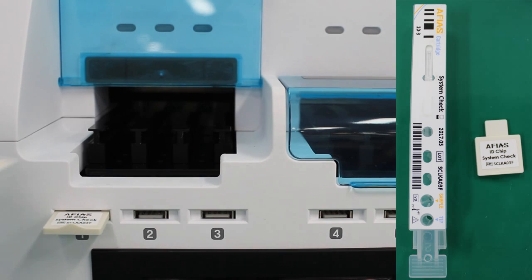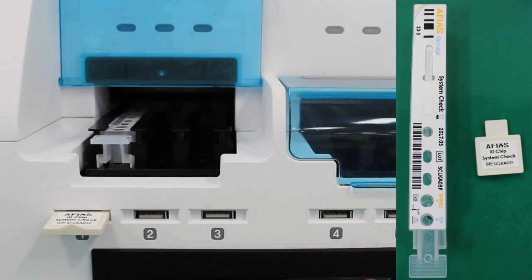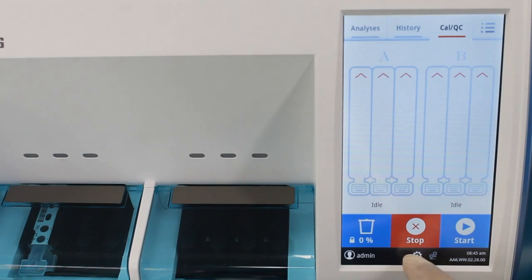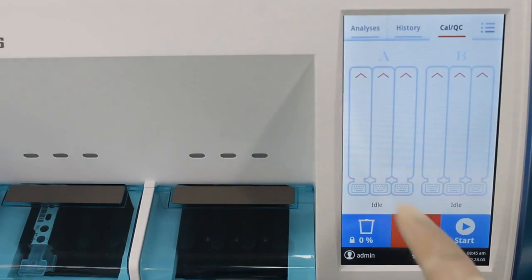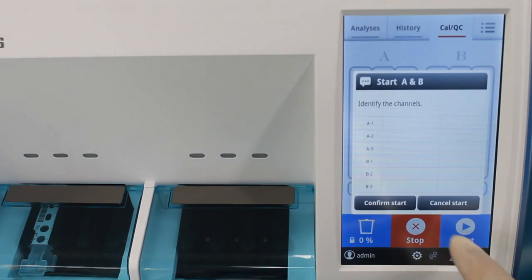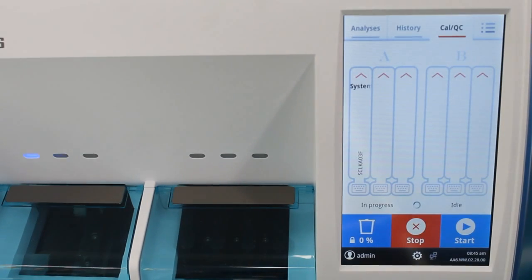Insert both the system check cartridge and the IDA chip. On the CalQC screen, press the settings icon and check system check cartridge enable. Go back to the CalQC screen and press start. The result will be shown on the screen and the printer output.